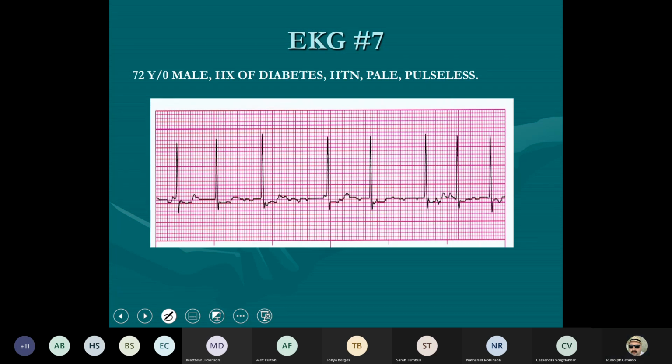Shane. What rhythm? A flutter. Okay. What if I said this? What rhythm? I'm not sure.